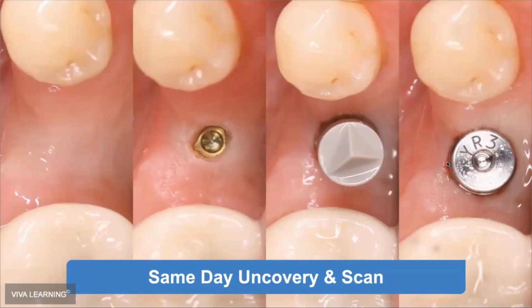So here's an example of a patient who had an implant placed. I place my own implants, but every now and then I get an implant from a surgeon that's buried or relocated, and I have to uncover the implant. That's obviously not that big of a deal when you have a laser. But the first step is to apply topical. I almost always place topical in these cases. The better you get with the laser and managing patient expectations, you can get away with not using topical, but it's so easy to apply that I just do it almost always.